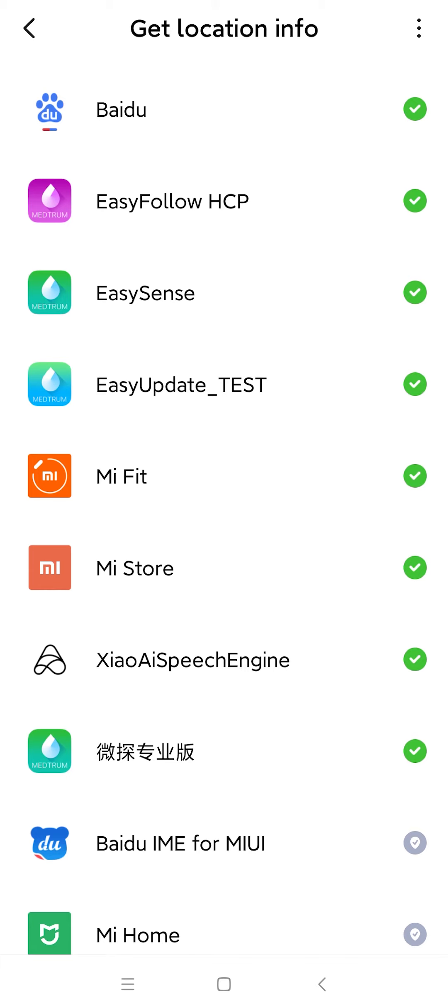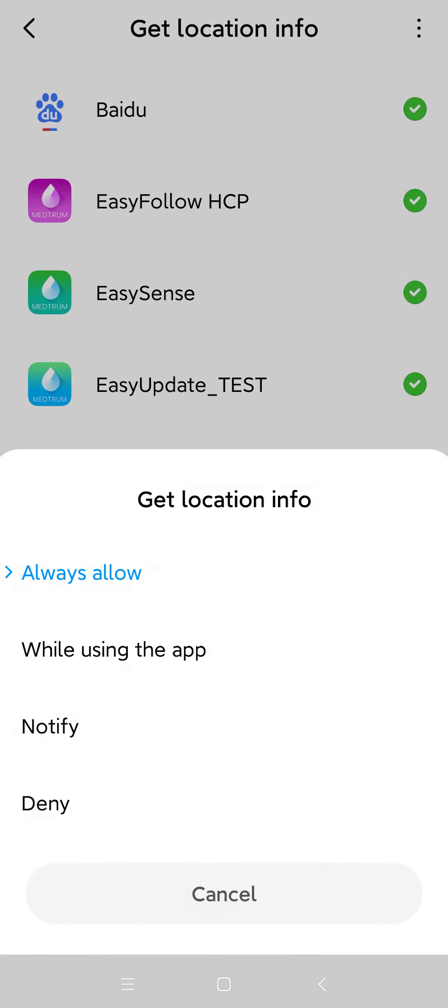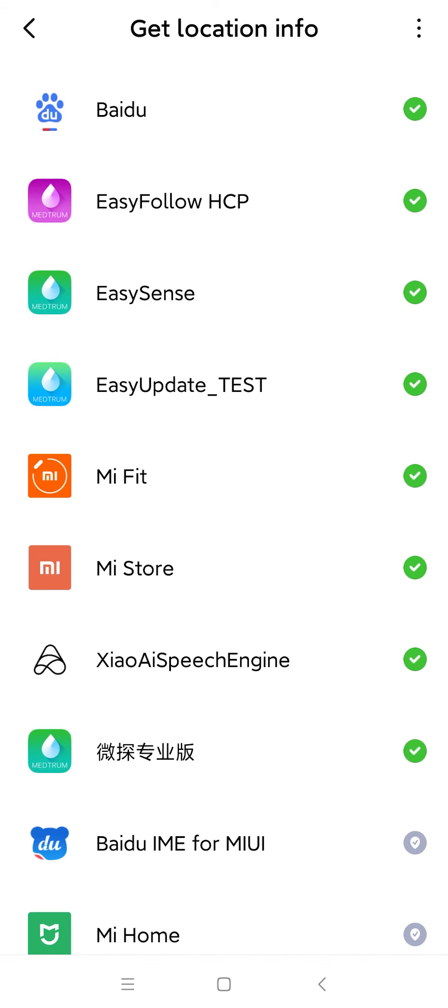Click on the EasySense app and select the Always Allow option. Go back to the Settings page.